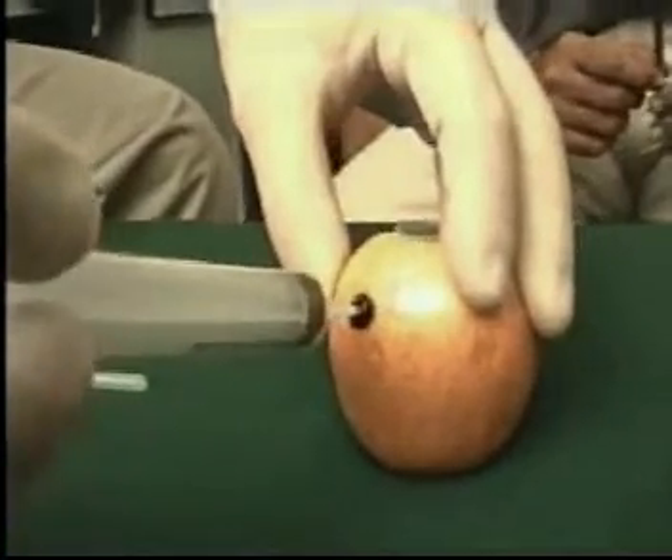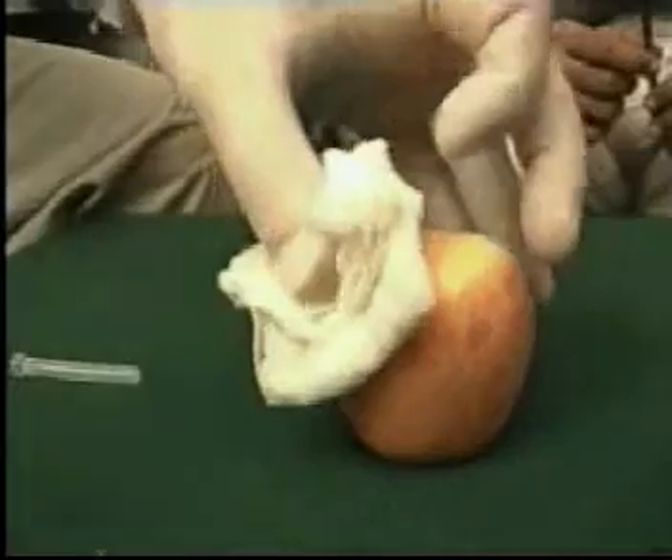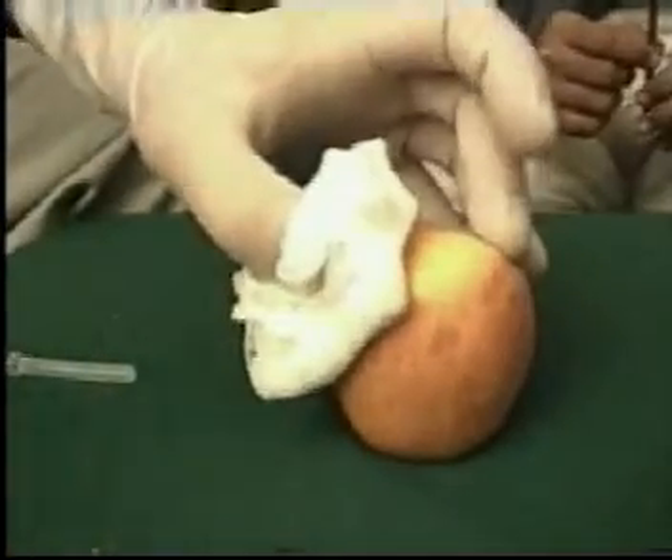Gently let the pressure go, remove the needle, and hold the area where you have taken the FNA from and pressurize it.